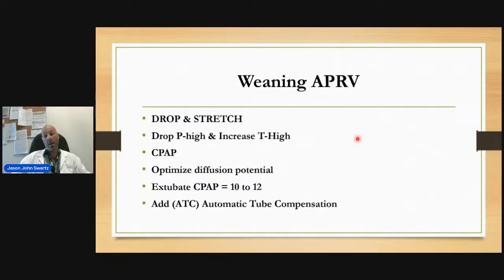The lung's improving, so your volumes are going to start getting bigger with that P high setting. So you can start reducing the P high as volumes start reaching, often 12 mLs per kilogram is what we tolerate during the release. It lets us know our lung is likely fully recruited. If you're hitting 12, then it's time to start weaning your P high.